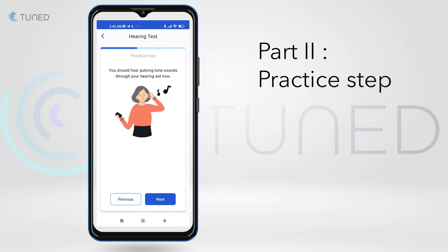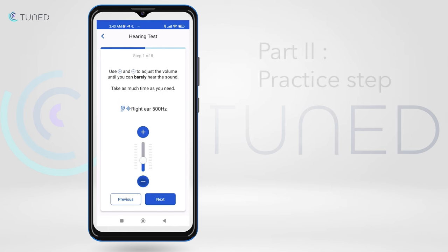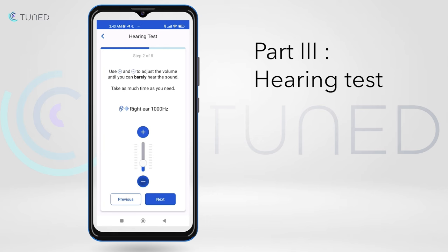The user is requested to, with a volume control bar, adjust to the point where the tone is barely hearable. Once the practice step is complete, the user will repeat these steps for four frequencies in each ear.